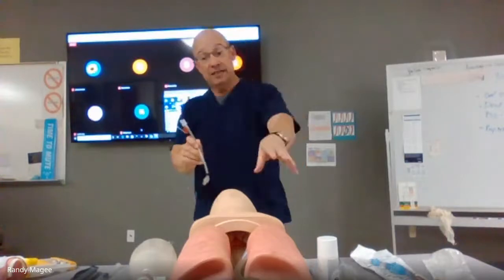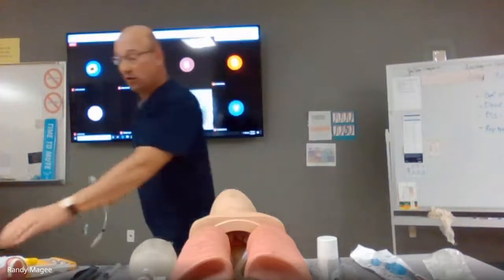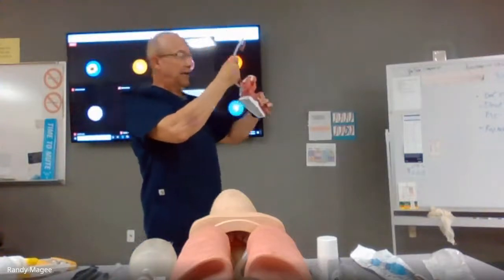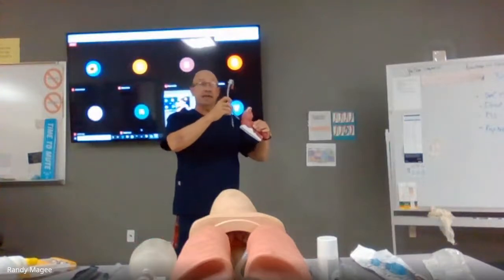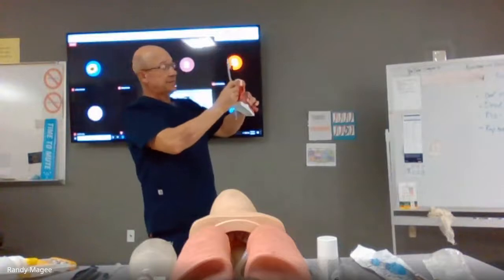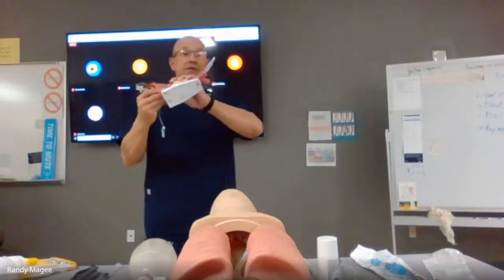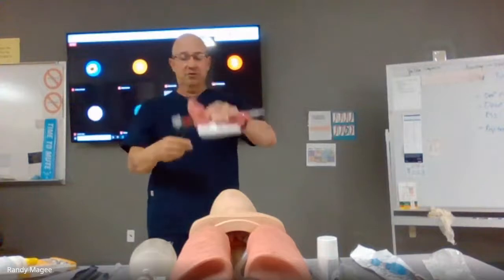And then one lung is not expanding the way that it's supposed to. But as we look through here, you can't see it, so I'm going to look at the anatomy. I know that the vocal cords are right underneath the epiglottis. So I'm going to find the epiglottis, and then I'm going to pass my tube through there. I'm going to really stick this through there, okay? That doesn't go there. That's way too far out.